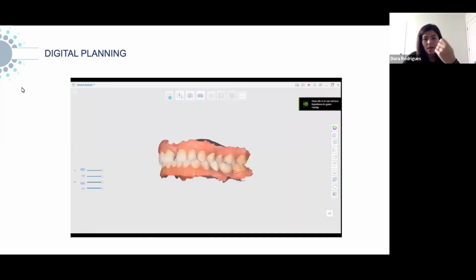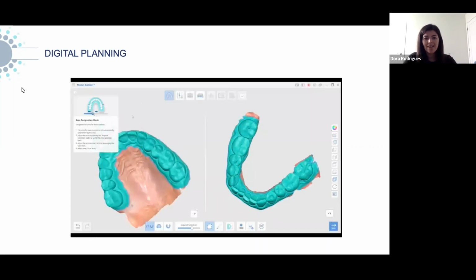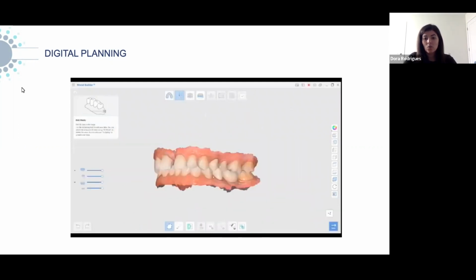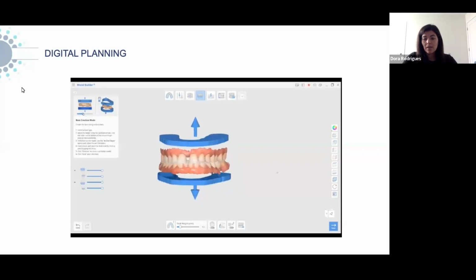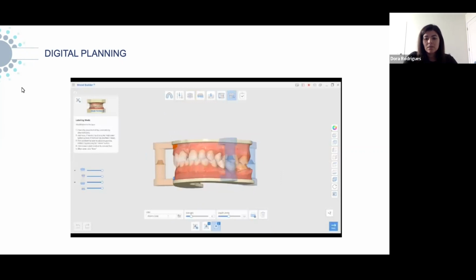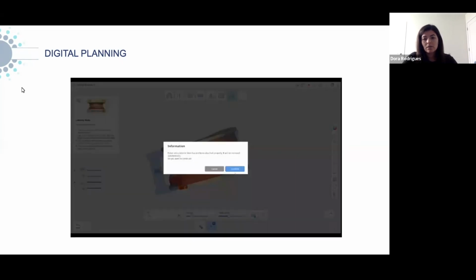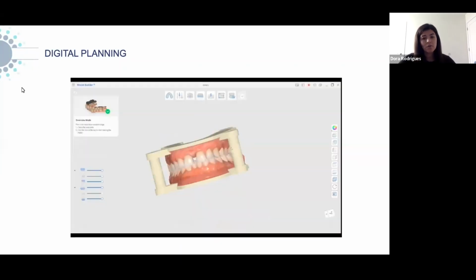So basically, let me lower the volume a little bit. So basically, I scan myself. This is me. I scan myself, and I just add the models into the software. You just select the area that you want to keep in your model, and right away they are aligned. You select the base that you want to add on the models. It creates the bases right away. Because they are in centric relation, I just added the pins. And then you can just add the name of the patient to it, and then you're done. So it's less than 5 minutes, and it's something that is very easy to do.